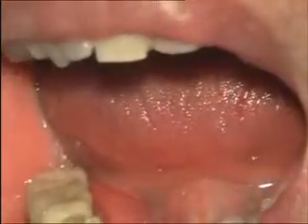Hear the sound. You are getting the implant for some time right here.